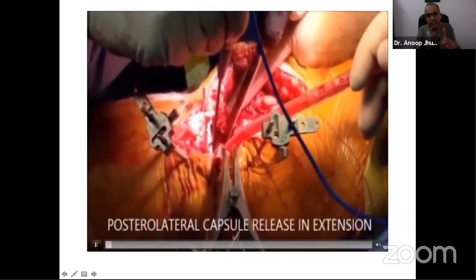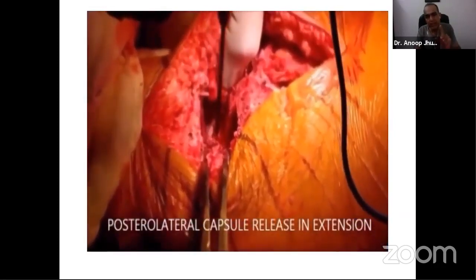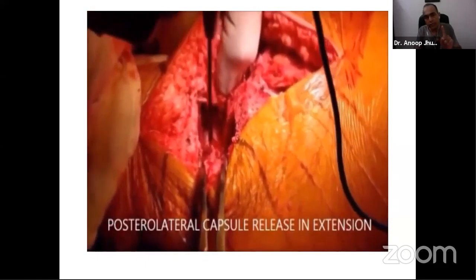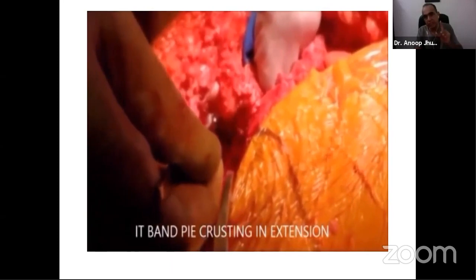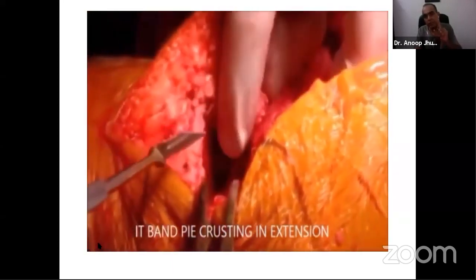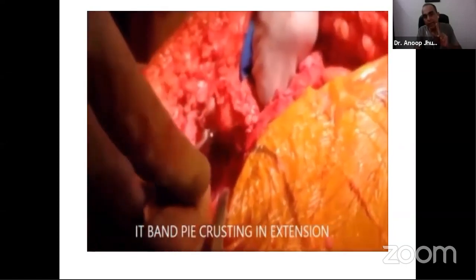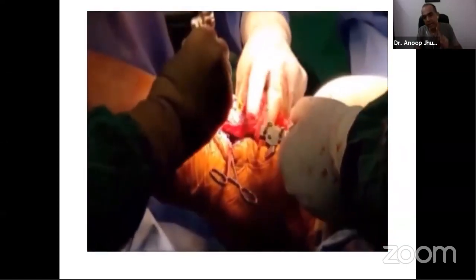So this is the knee in extension. You can see the CAS pins. The laminar spreader is on the medial side. You take a long cautery tip, not the routine one, and keep the cautery on 30 or 40 and feel and cut the curtain-like capsule in extension. Then to correct further under navigation control with 11 number blade, the IT band, which is just below the quadriceps tendon, and check again periodically.